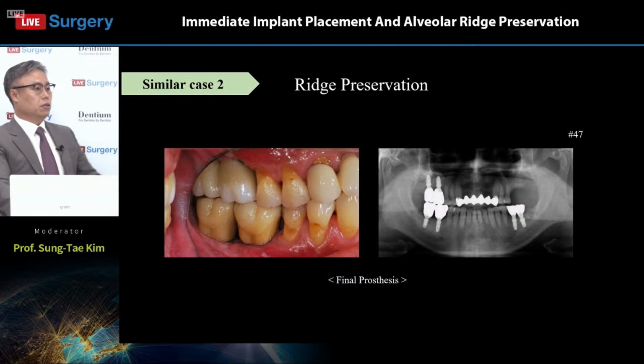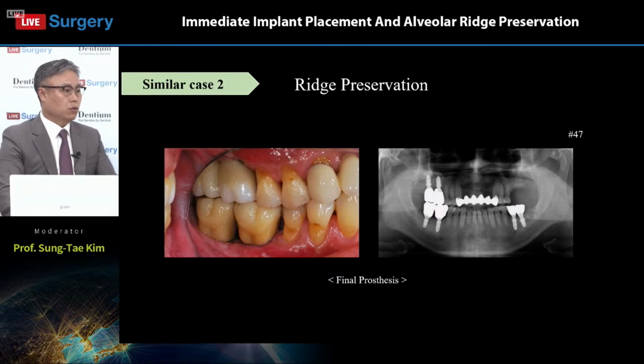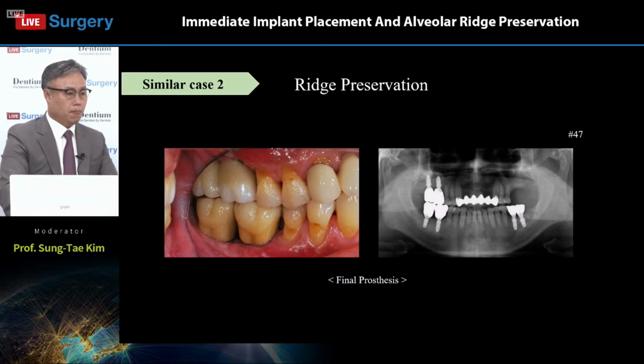Okay, these were the two similar cases. As I mentioned, the immediate implant placement in the upper premolar area and the other ridge preservation in the lower second molar area. Let's go to the clinic.